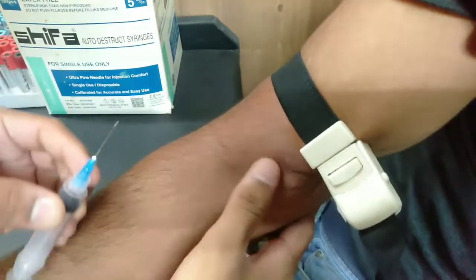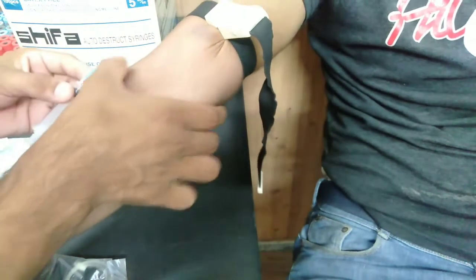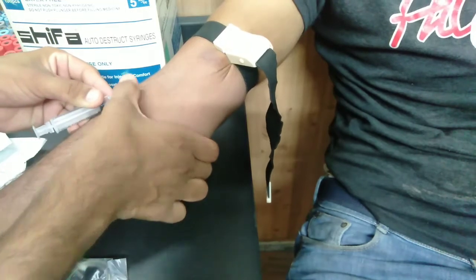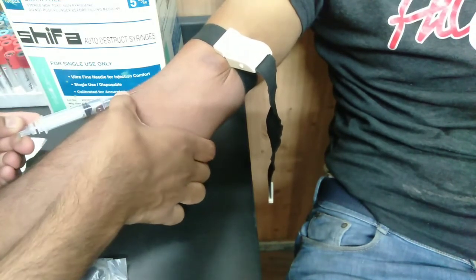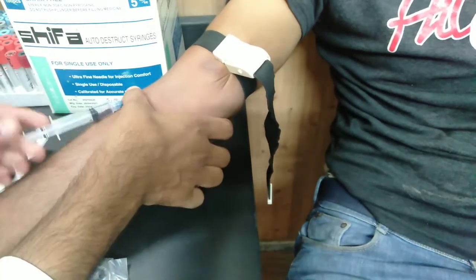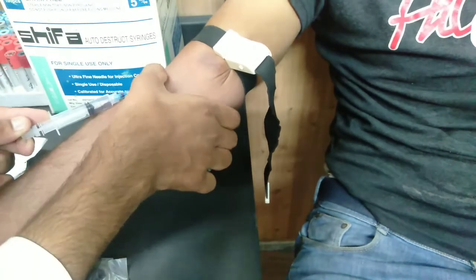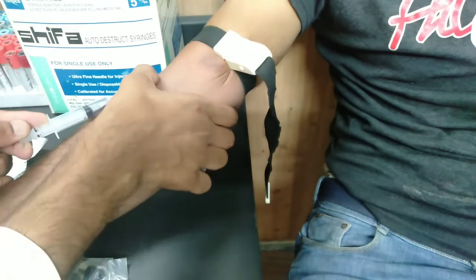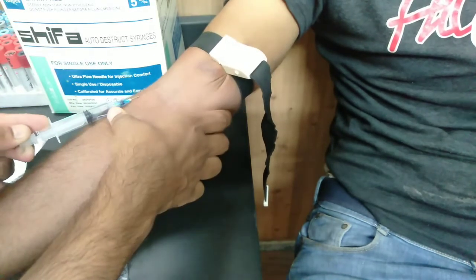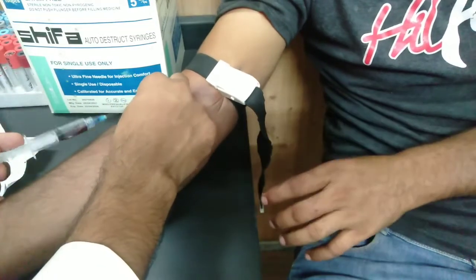Then we will find the main vein. We must angle the needle to enter the vein. If we miss it, we can move it so that we can get the vein. I have missed it and then I will show you the vein again. We have to get the needle to the top and the syringe to pass in. As we do it, the blood has started. With that, I have taken the patient's blood.